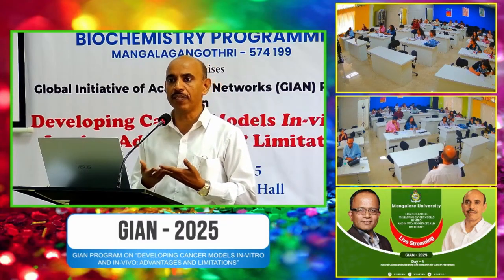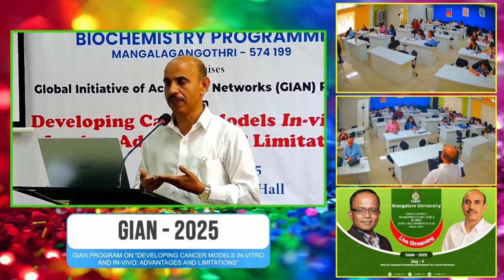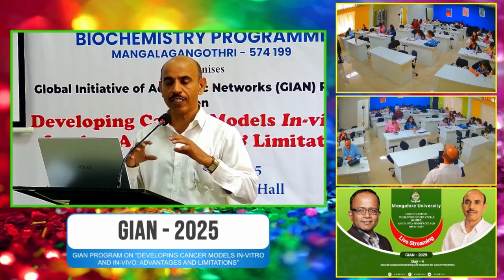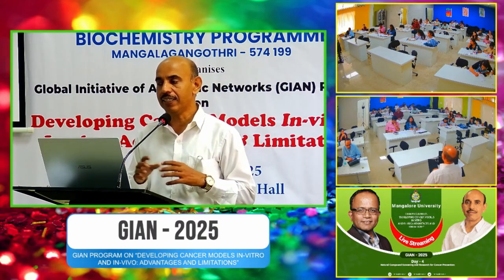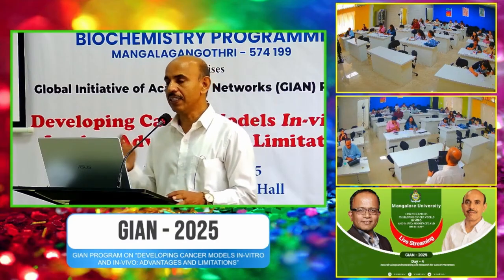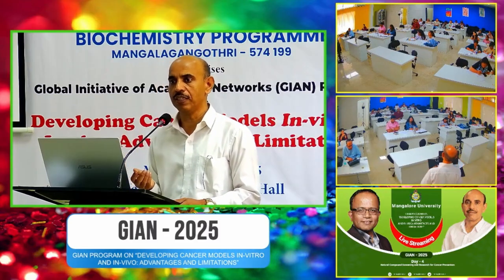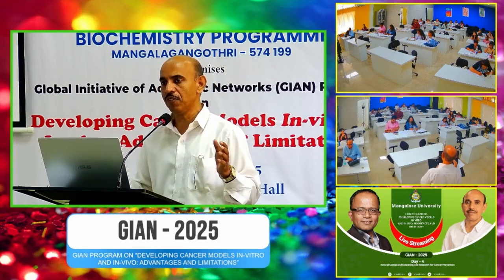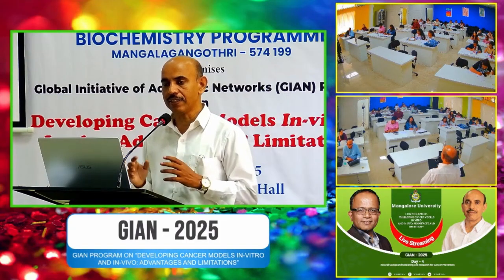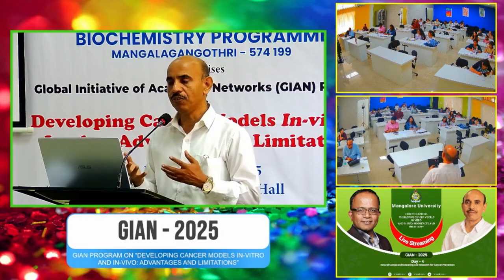You find out what is happening in that time, and accordingly you have to design. Sometimes the cells will not detach, and at that time you have to increase the trypsin concentration. Or sometimes the cells will not grow, maybe because you have added too much trypsin, or you have kept it for a long time for the action of the trypsin. So once you analyze it the next day, you will get an idea whether you have done it properly or not. This is what you can do.